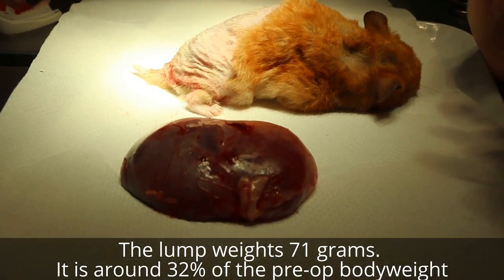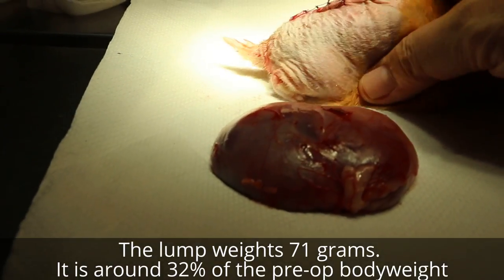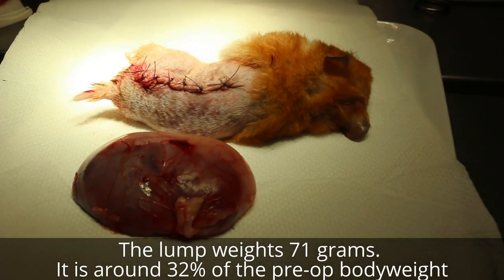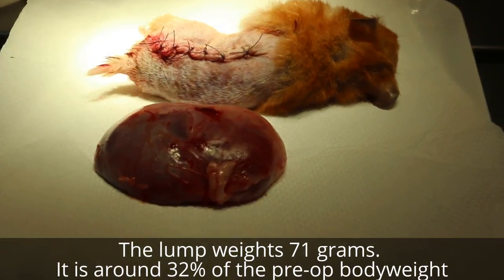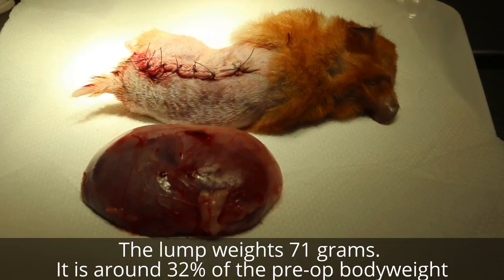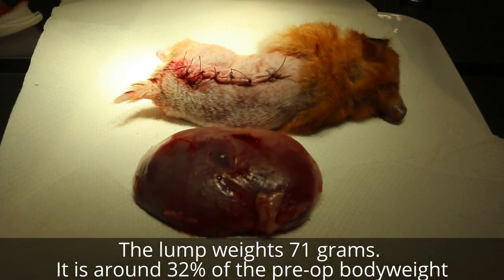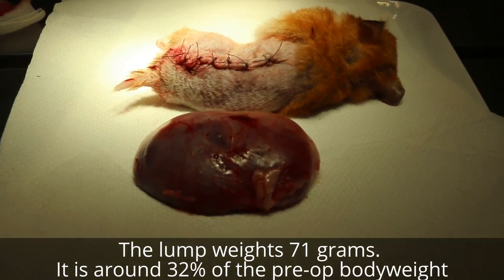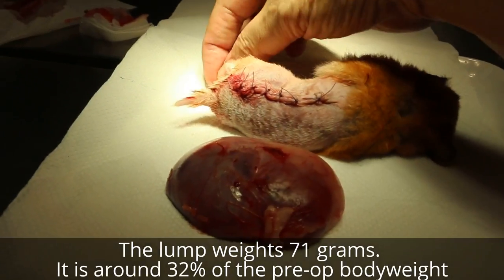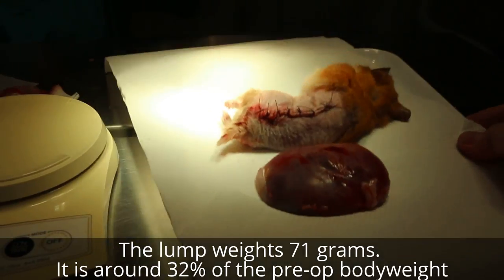We take a weighing machine and see what's the weight. Okay, I'll check up the hamster. Yeah, he's still sleeping. It's basically based on isoflurane gas anesthesia to effect, and got to be very careful because too little they die from shock, too much of course you die from overdose. Now you can see I stitch out at 4-0.